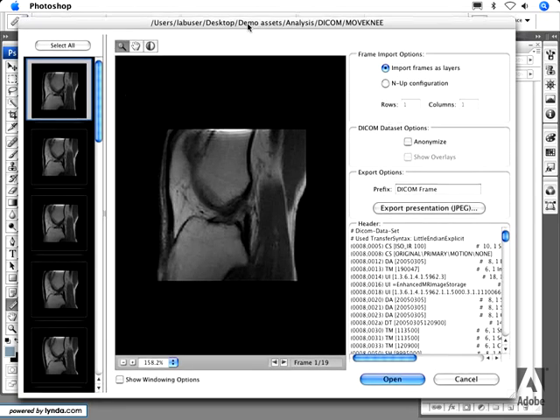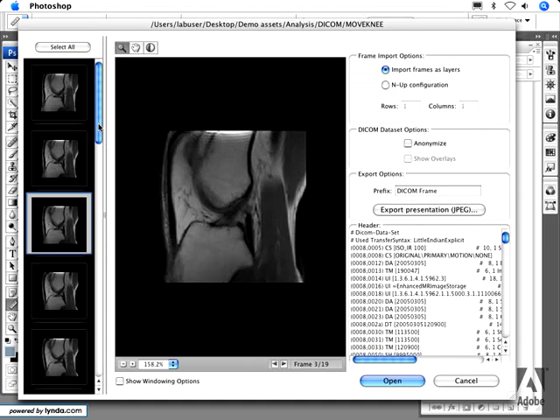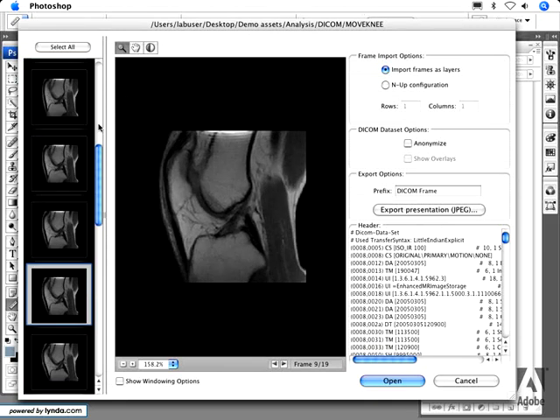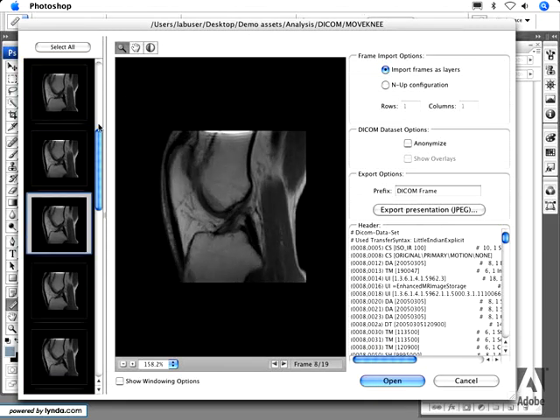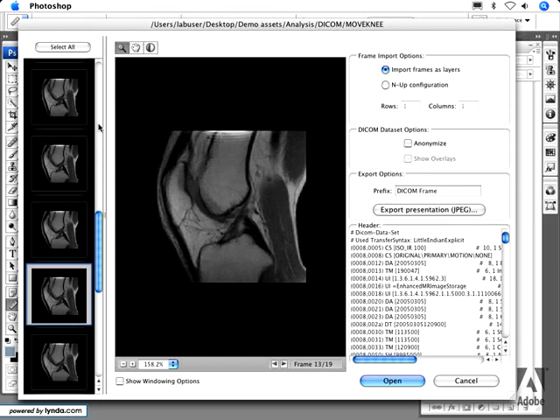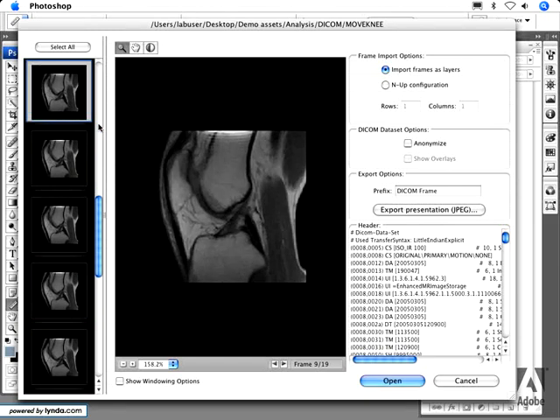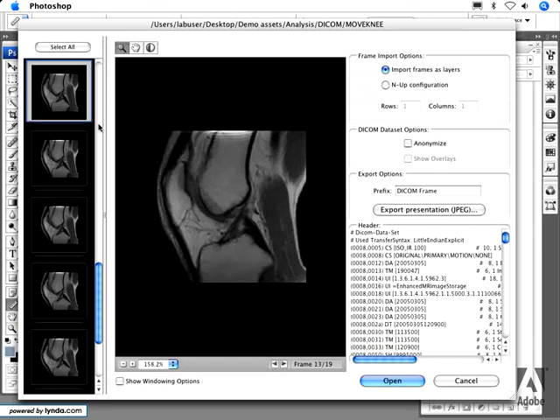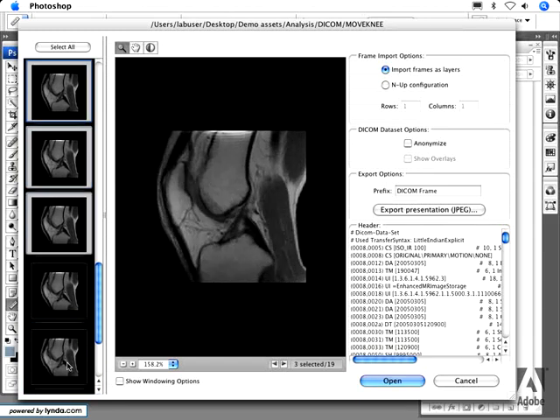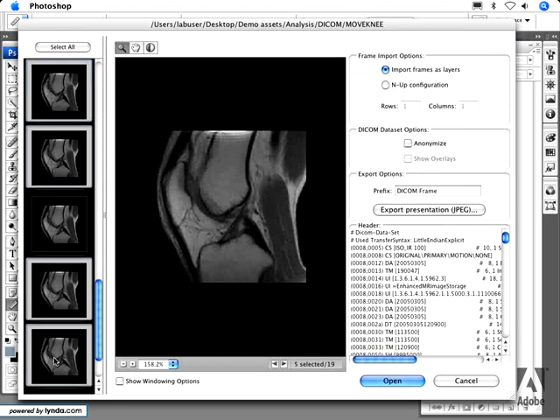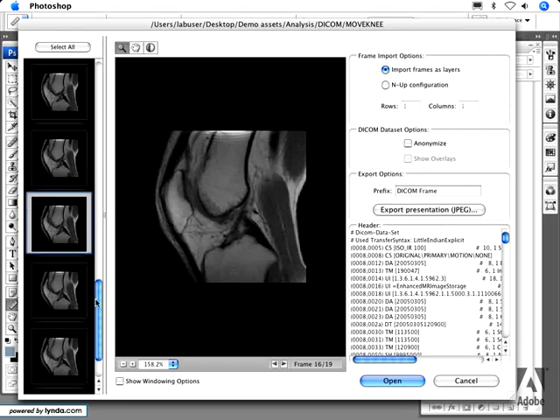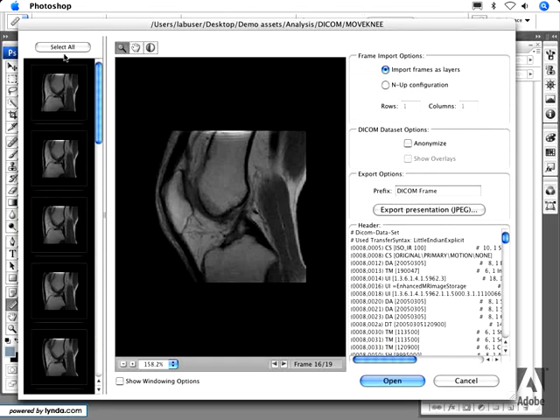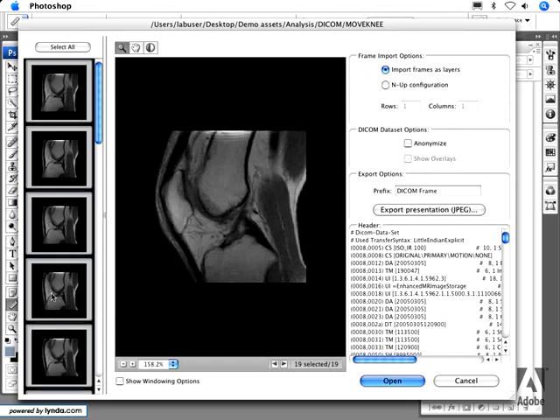You will enter a dialog box that enables you to select individual frames that you want to import into Photoshop, and how you want these to be imported. You can navigate through the individual frames using the up and down arrow keys, and use the standard Shift and Command or Control options to select subsets of the frames contained within the DICOM file. You can also select all of them if you want to bring all frames into Photoshop.